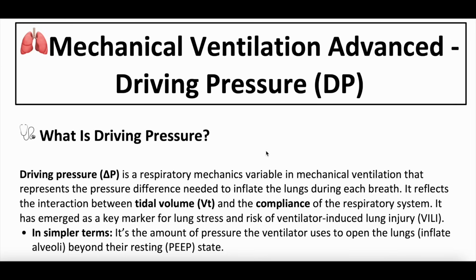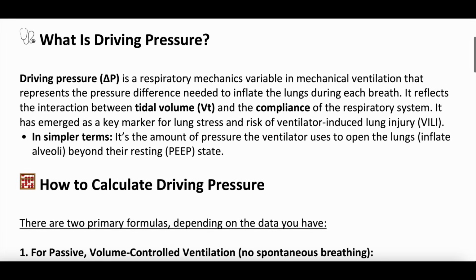Let's dive into driving pressure. What is driving pressure? Well, driving pressure is a variable that we can determine when someone's on mechanical ventilation, okay? It represents the pressure difference needed to inflate the alveoli during each breath. And we're going to come back to that as a concept. It kind of represents this interaction between tidal volume and compliance of the respiratory system, and it's really emerged as a marker for lung stress and possible risk for ventilator-induced lung injury.